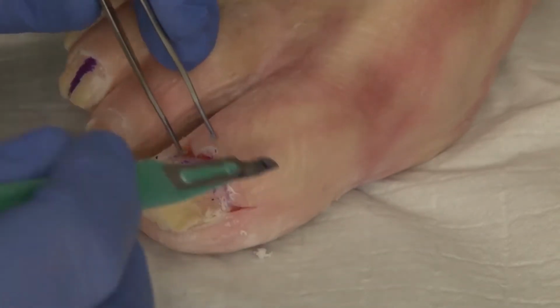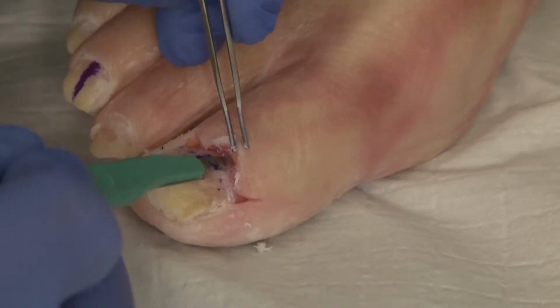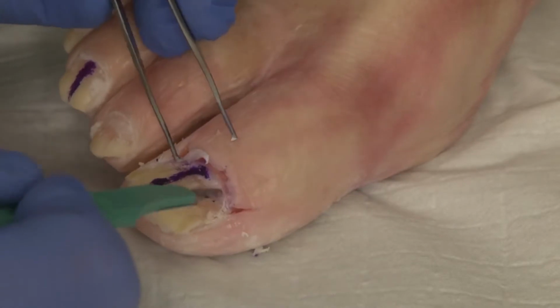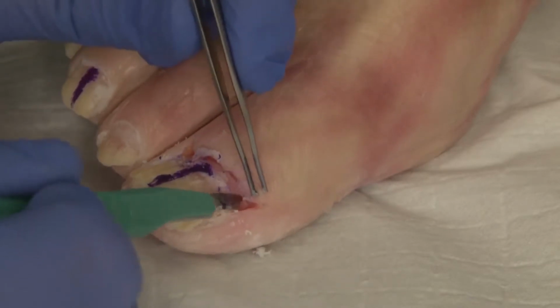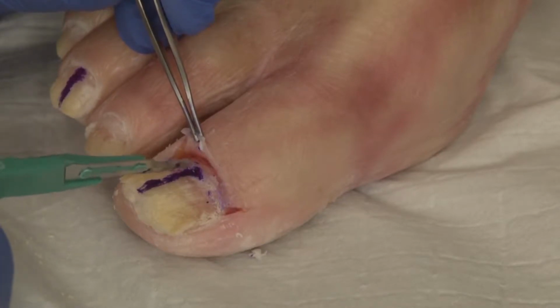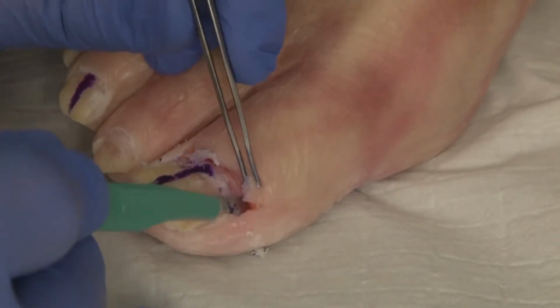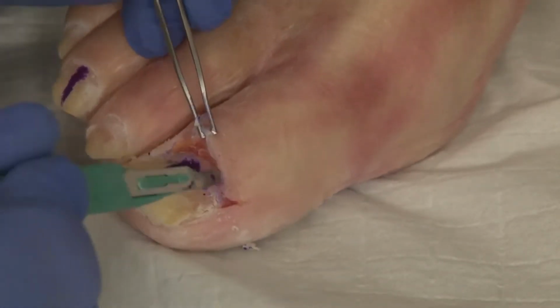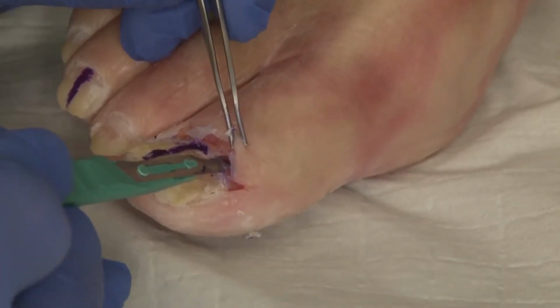to the nail matrix. The reason we have to do this is to identify the most proximal aspect of the longitudinal streak, because the longitudinal streak, wherever it ends proximally, is the area of the biopsy. So when clinically we see the streak approach all the way to the proximal fold, we have to make sure that we reflect the fold to see how far it actually goes. So for purposes of this demonstration, I am going to mark the matrix under the fold to simulate a lesion that begins in that spot.